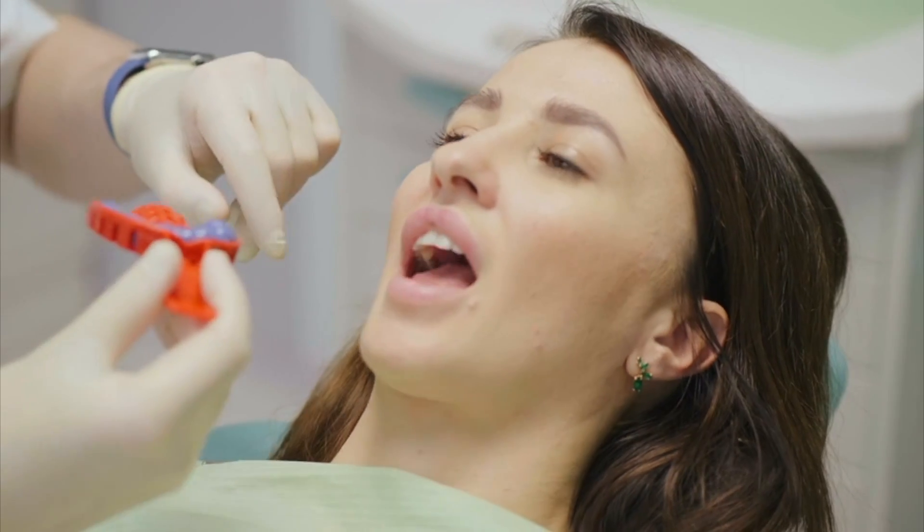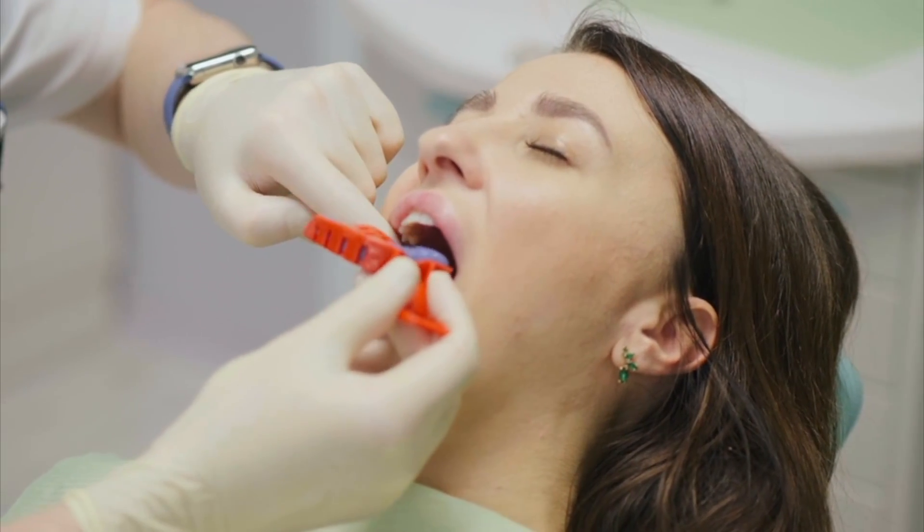In our office, our doctor has really enjoyed it because he doesn't have to take goopy impressions anymore. But it turns out we can actually use iTero for lots of different things — patient education, showing patients about their occlusion, specific areas of decay, broken fillings, and of course Invisalign. Whether we're doing a night guard or fixing the bite with Invisalign, the scanner is a very useful tool.